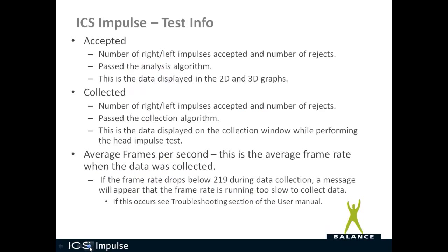So again, we've talked about this. The accepted number, so there are two different algorithms. Remember this, there's an accepted analysis algorithm and there's a collection algorithm.